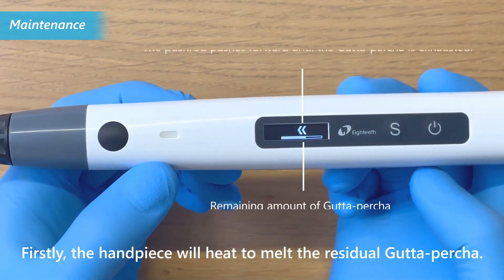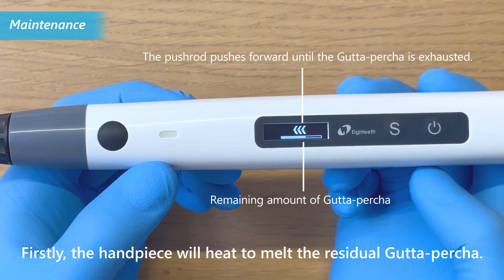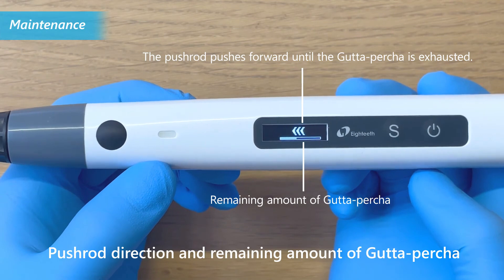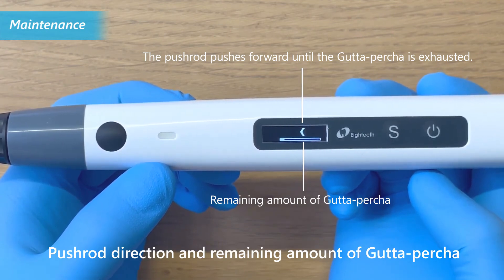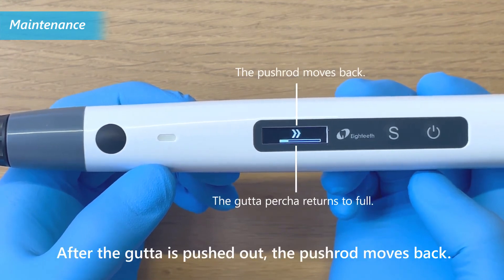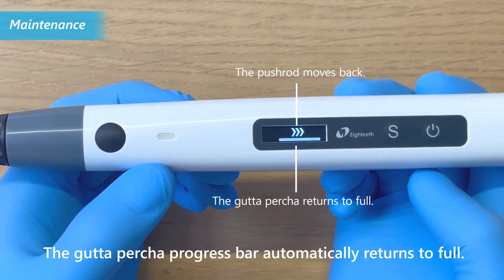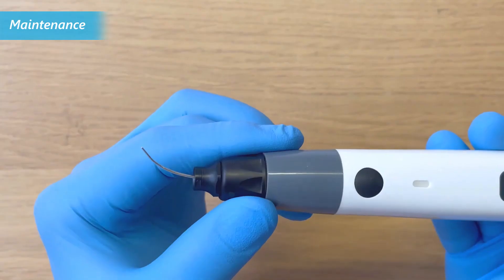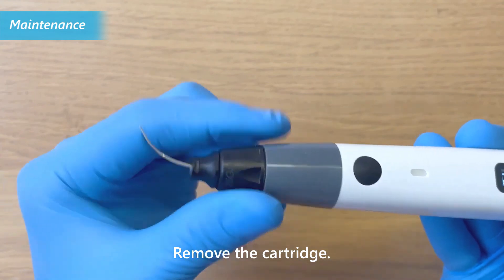First, the handpiece will heat to melt the residual gutta percha. Second, the pushrod pushes forward until the gutta percha is exhausted. The pushrod direction and remaining amount of gutta percha will be displayed on the screen. After the gutta percha is pushed out, the pushrod moves back and the gutta percha progress bar automatically resets to full. Remove the cartridge.